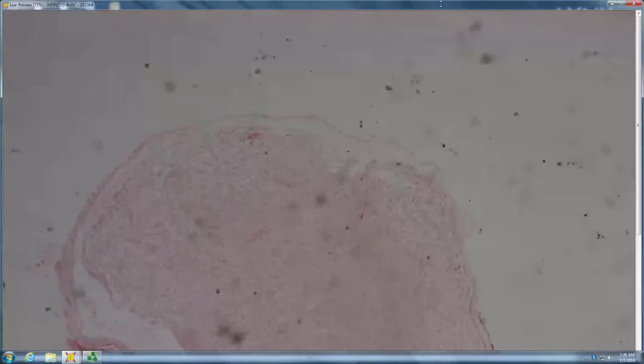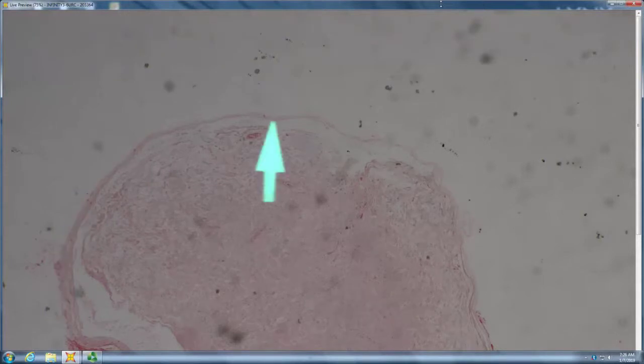Okay, so there's a pretty well circumscribed, myxoid-looking proliferation. I don't really see epidermis. Is it encapsulated? It is. Is it uniformly edematous, or do you have intact fascicles? It looks like there may be intact fascicles. So what do you think? Is this a neurofibroma? Intraneural neurofibroma. You are correct. And you don't have to be sorry. You're good.